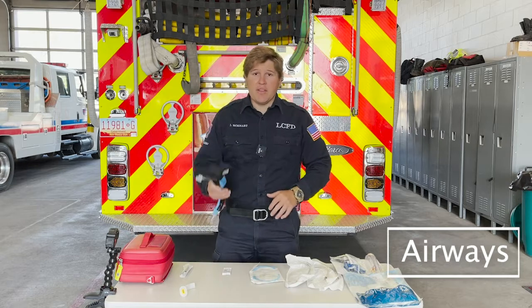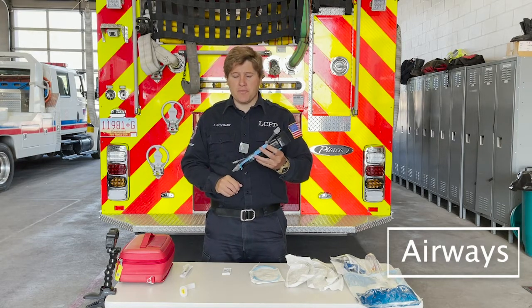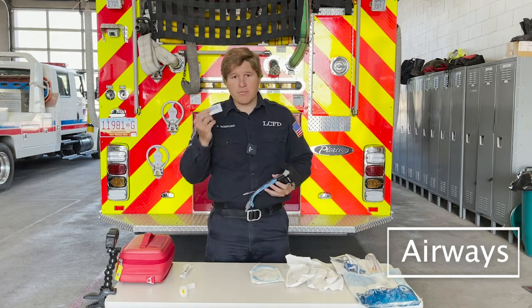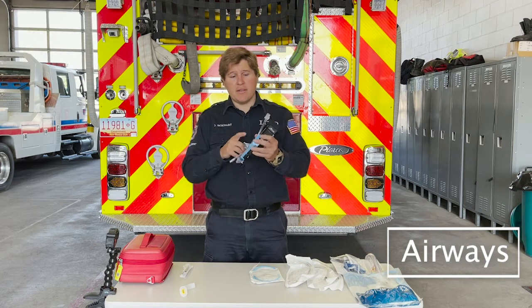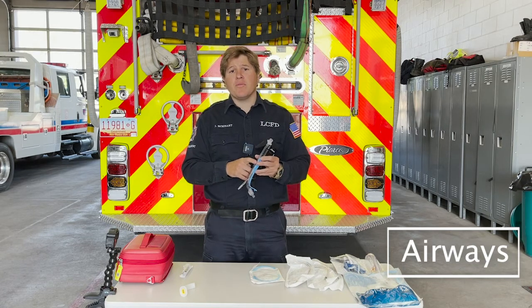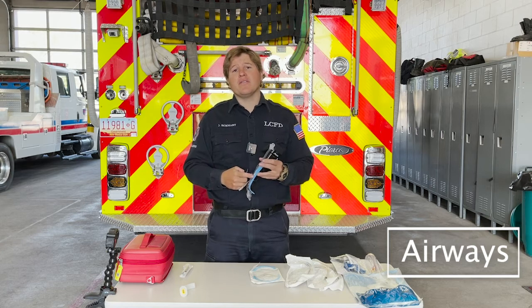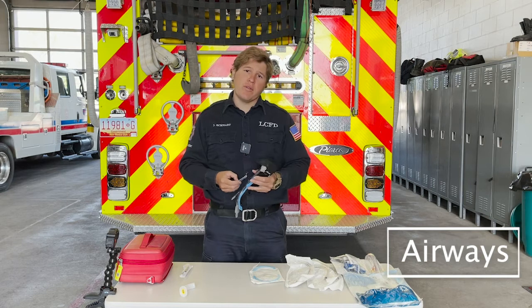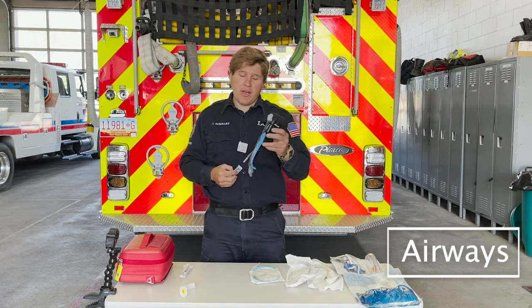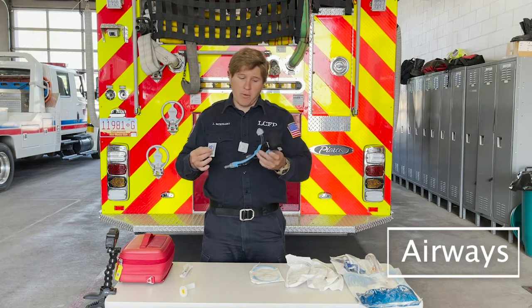The next one is getting the video laryngoscope ready. Having it ready, having it turned on, understanding how to use it. Lubing the endotracheal tube that you're going to use and placing it into the video laryngoscope. I know recently I pulled one of these out and there was a stylet already in it. So making sure that if you did have a stylet, you'd want to pull that out for the video laryngoscope. So having that ready to go, apply the lube so that way it moves freely for your success.